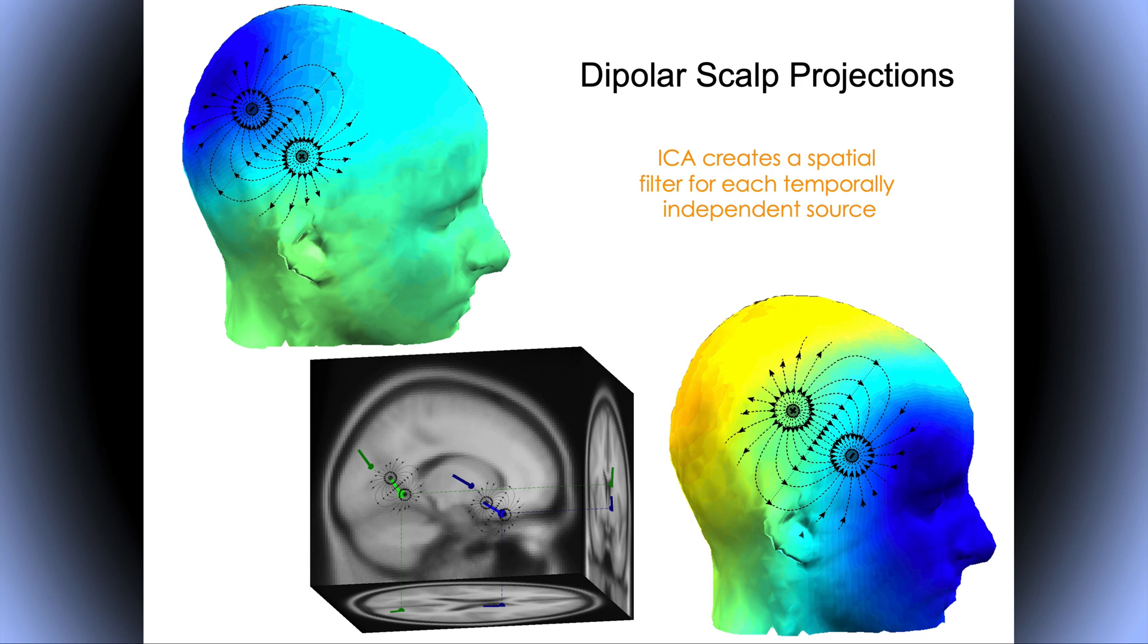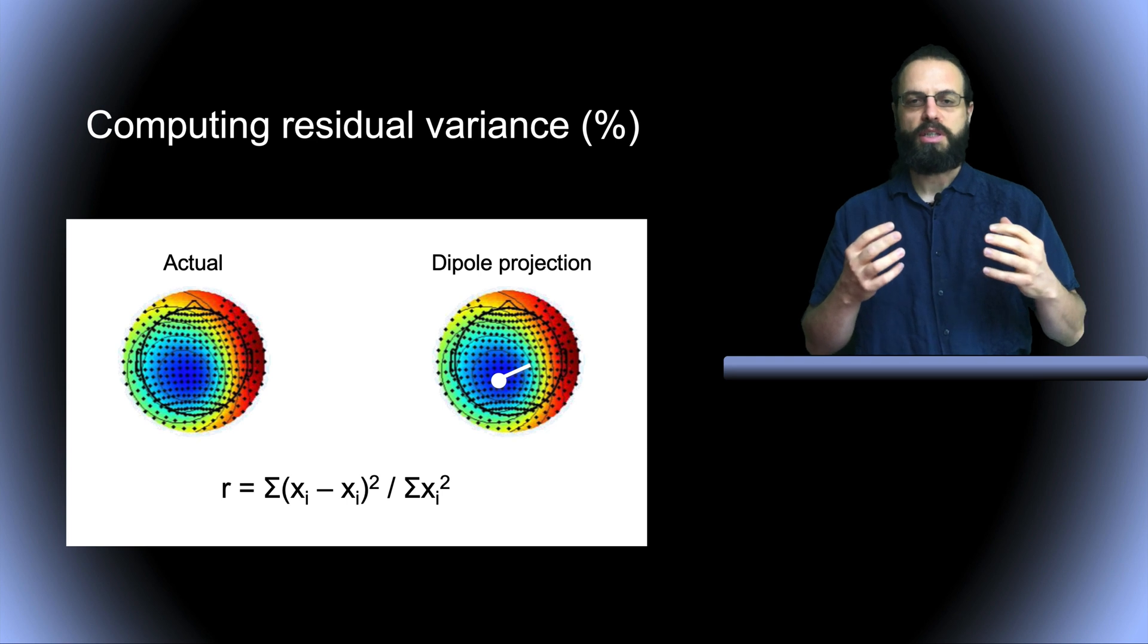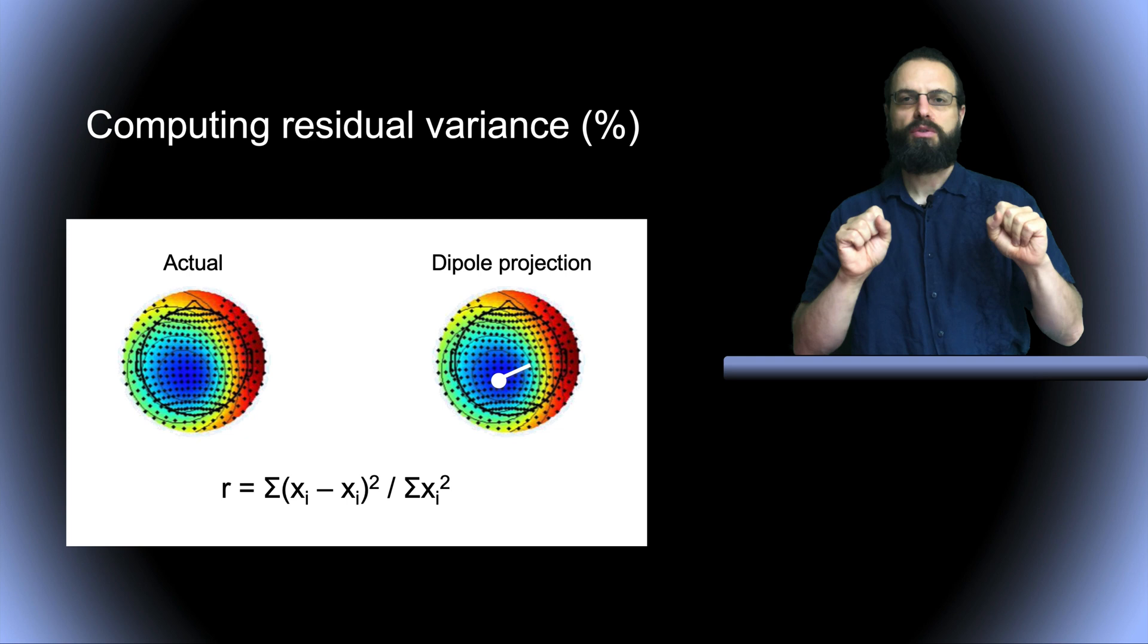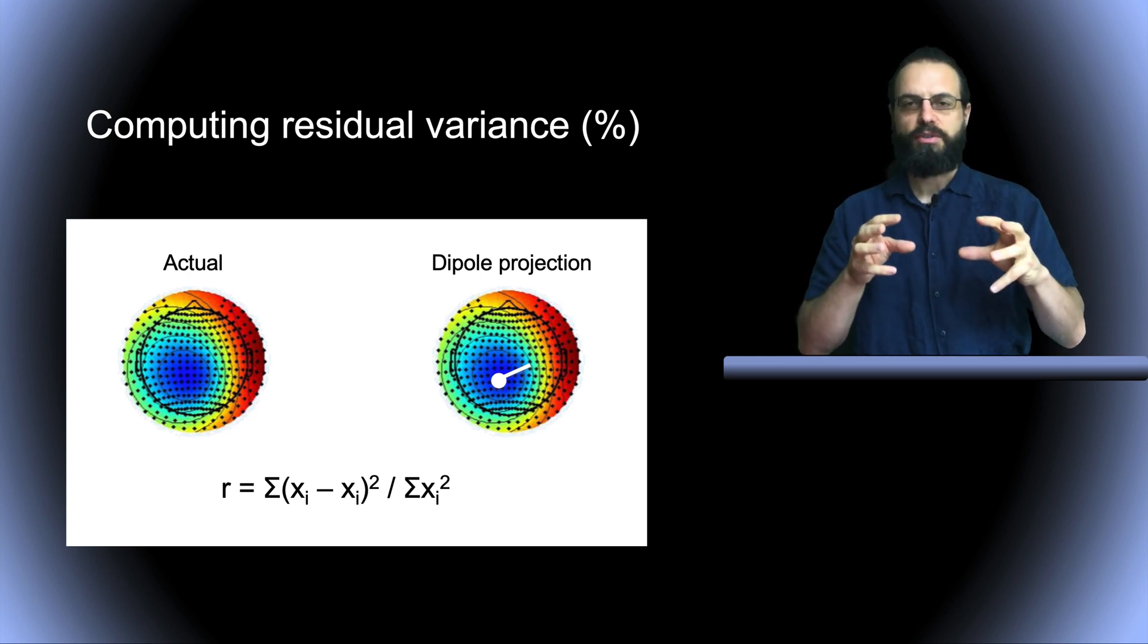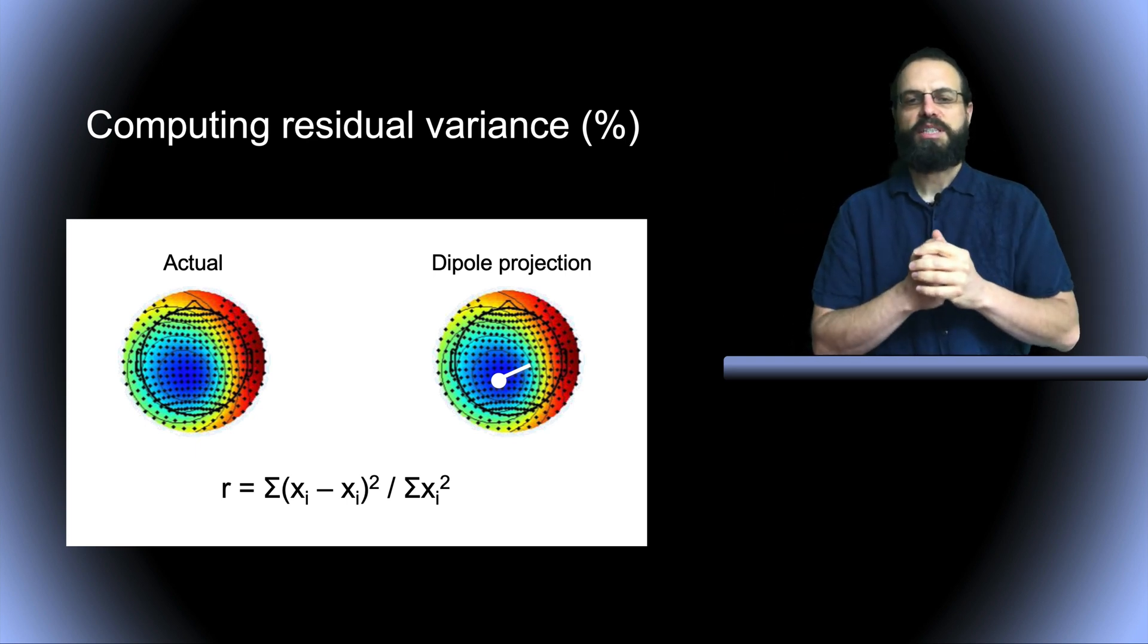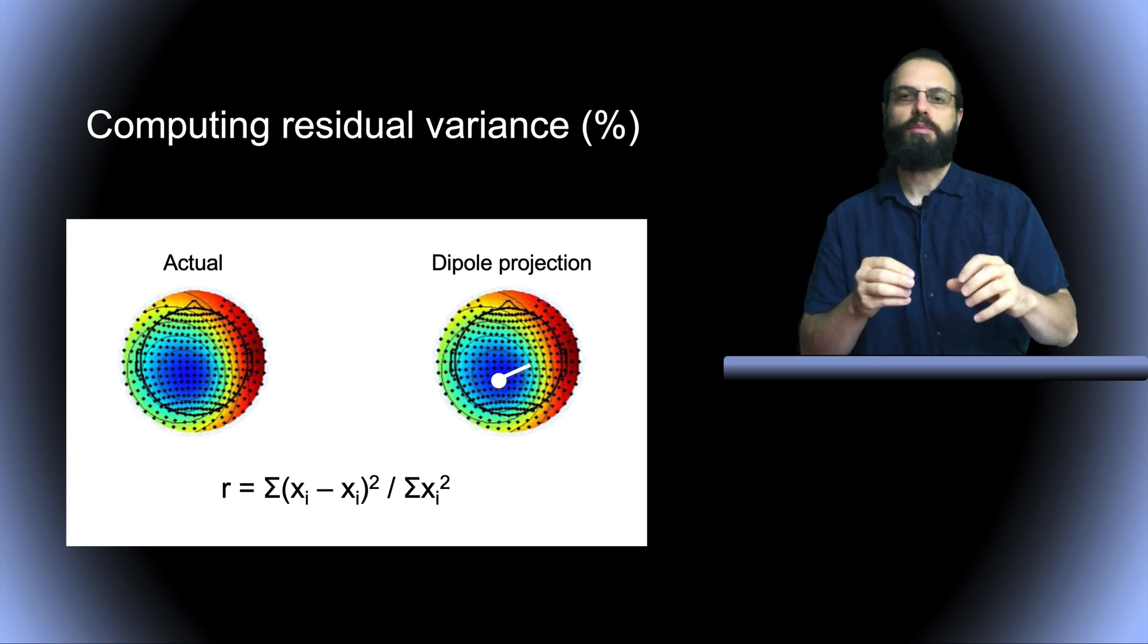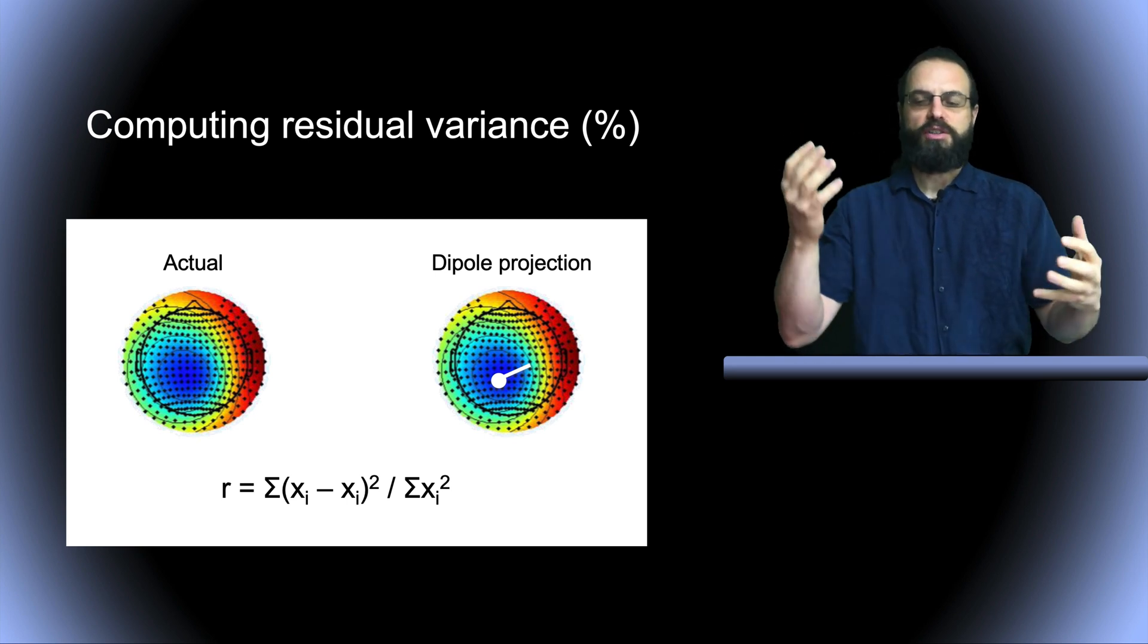ICA creates spatial filters for each temporally independent source brain source. To do this, we need to compute residual variance. On the left here, we have the actual data. On the right, we have the dipole projection. What we're going to do to see if the ICA component can be modeled using a single dipole is subtract the two maps and see what's left. That's called the residual variance. If the fit is really good, the residual variance is very low, a number between 0 and 100%. If it's really bad, the residual variance is very high.